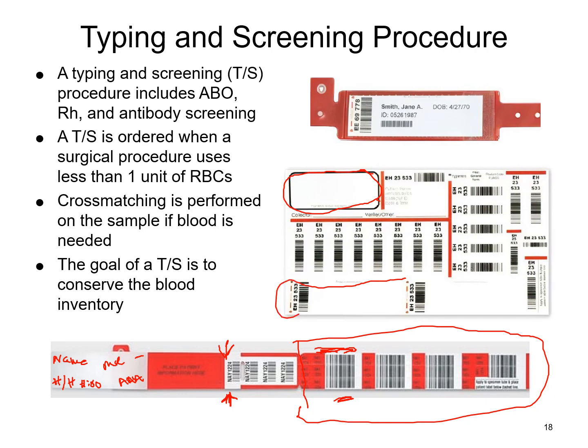I think this is where you would put your Avery label from your patient, or possibly your label that's in your computer system. So if it prints off a particular label for the test, maybe your test label goes here that's got the barcode on it, and maybe this is your label that goes on the patient. It's kind of hard for me to zoom in, and I've never worked with this brand, so I'm not familiar with it. There's just one that I could find an image of.